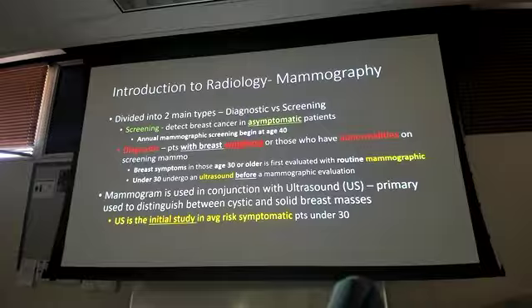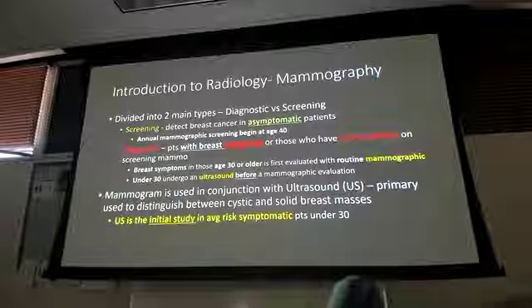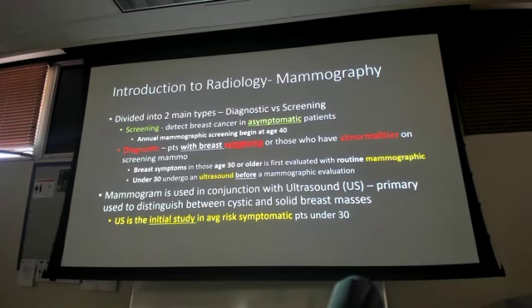Biggest one was, if ultrasound is not radiation, then why don't we just use it for screening, right? Really good question. The reason is, we use the ultrasound in the symptomatic patients because we want to try to avoid the radiation. And the nice part about symptomatic patients versus asymptomatic patients is, what can they tell us?